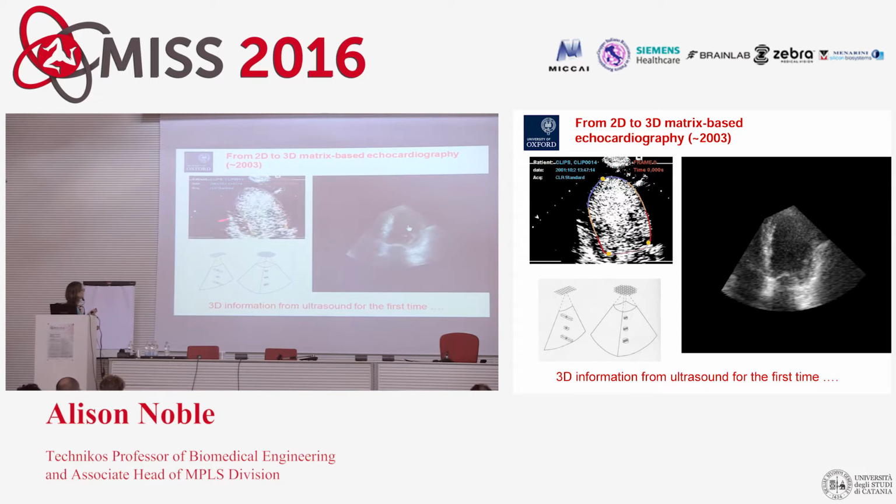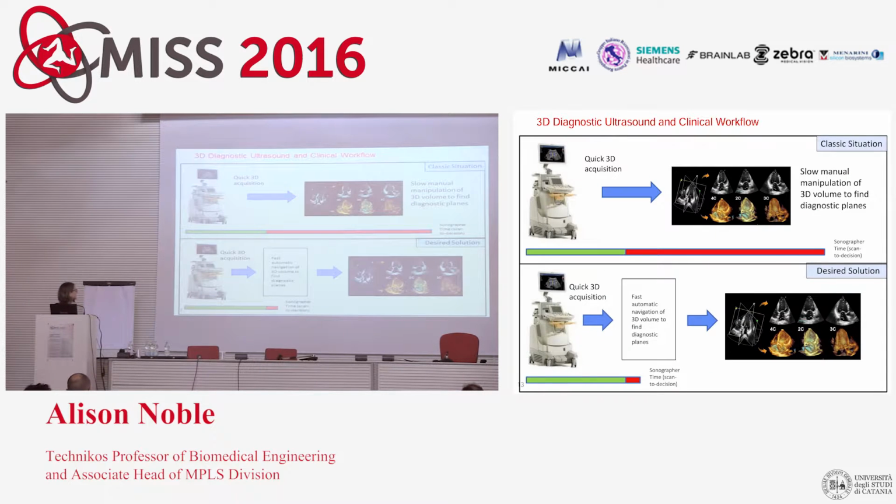So you went from data of this kind, which was almost binarized, to going from linear array data to 2D probes that give matrix arrays, so you could acquire 3D data. And this is just a slice through typical 3D data. Although you can get higher quality today, this reflects it at that time. So it was a very, very exciting time.